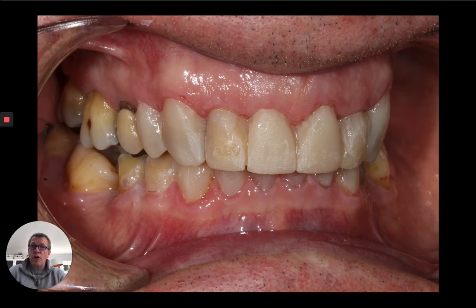If we've got more complex cases, then we can use things like Bellus 3D face scanning software to really accurately mount virtual models and also to assemble a virtual patient. That's useful. We have things like Modjaw, which gives us the function of the patient.